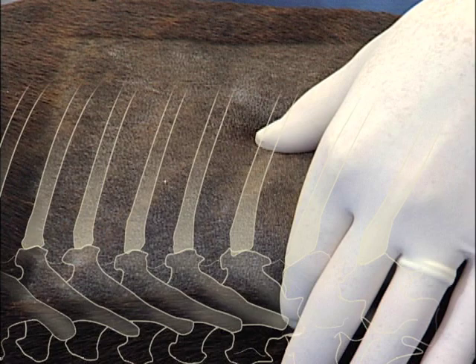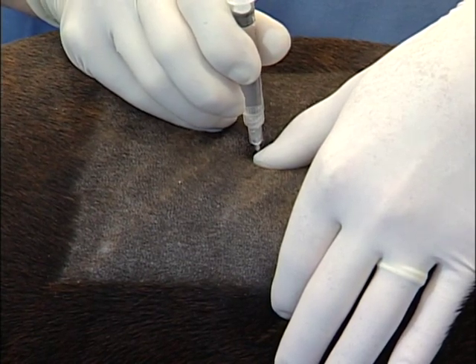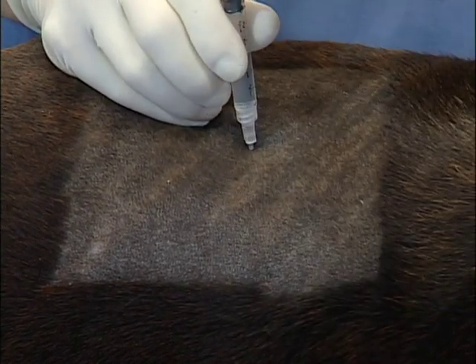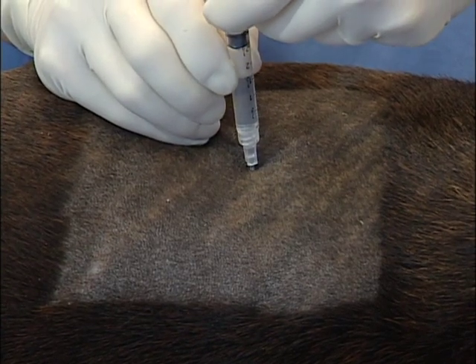Once we've found that location, we're going to take the syringe with our drug and insert it right over the rib or just the caudal aspect of the rib, inserting down just deep enough to feel the rib. We then want to aspirate to make sure we don't get back any blood or air, and then inject about a half cc of drug in this dog.